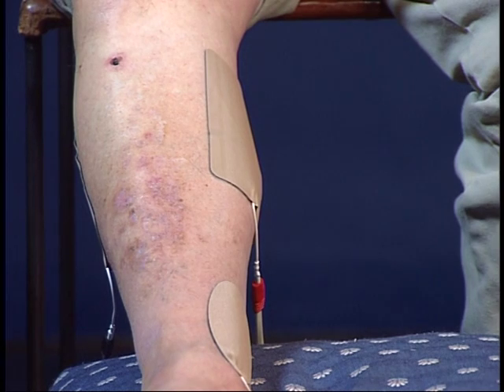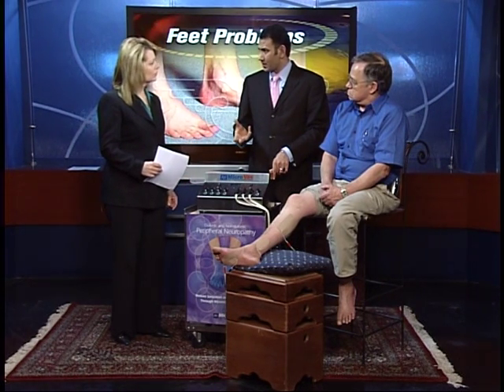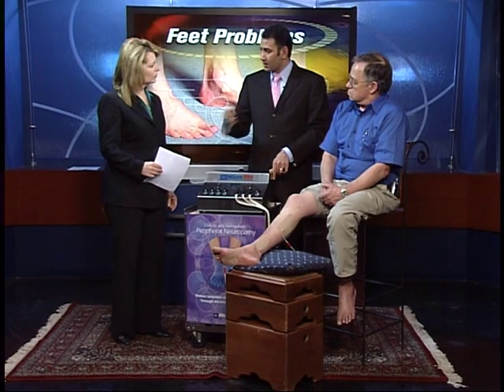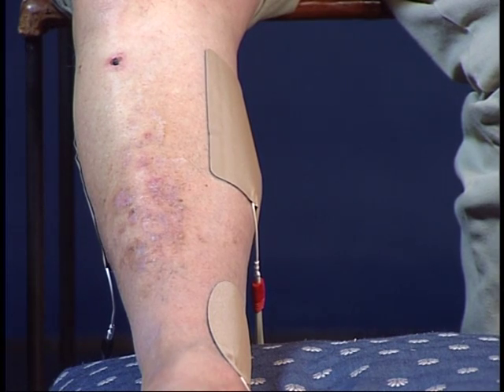The circulatory system is a closed system and blood is continually going from the heart to the feet, back up through the veins. If there are blockages, it's like a traffic jam on I-95 — everything's slowed down. What this does is increase the speed of the blood flow. The quicker things move, the more oxygen and nutrients we can get down to the foot. So it's pushing the blood through.